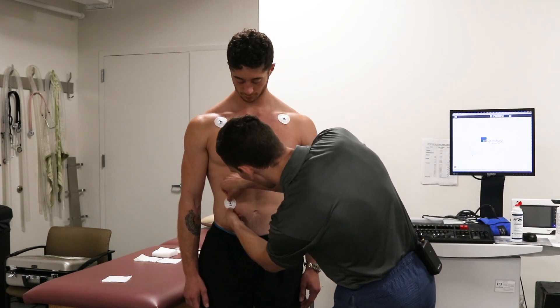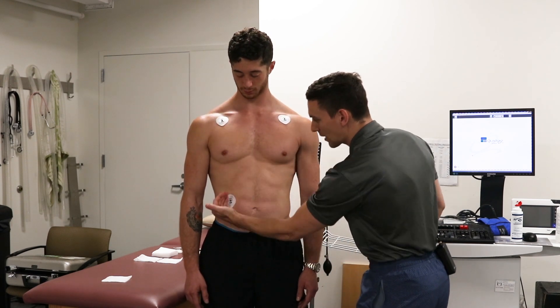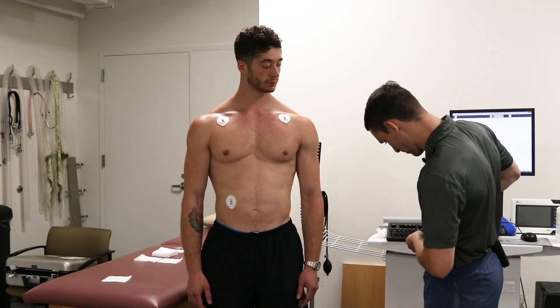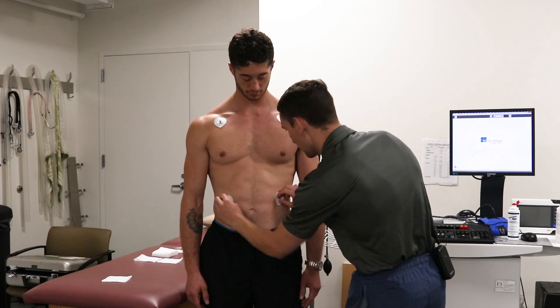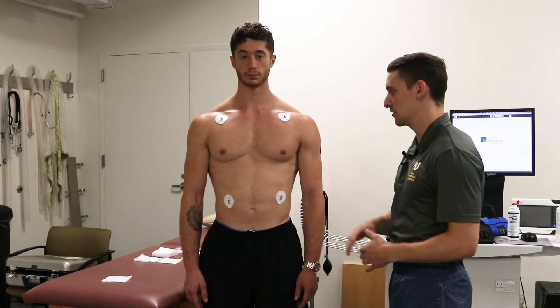We've got one electrode placed. If you notice, these should be just about directly on top of and below one another. And we've got two. Those are just our reference leads.